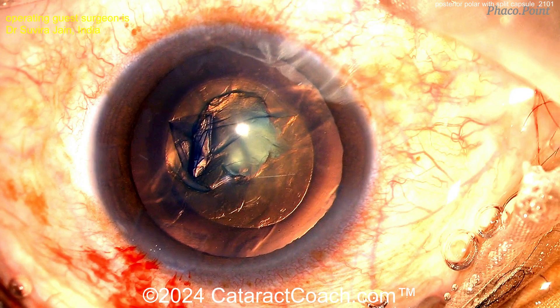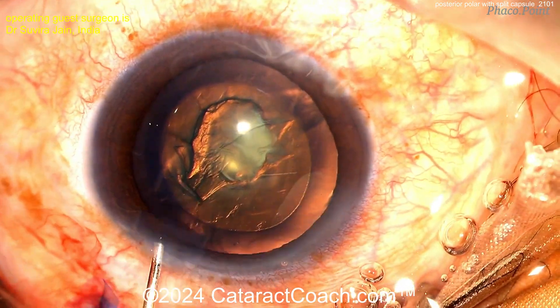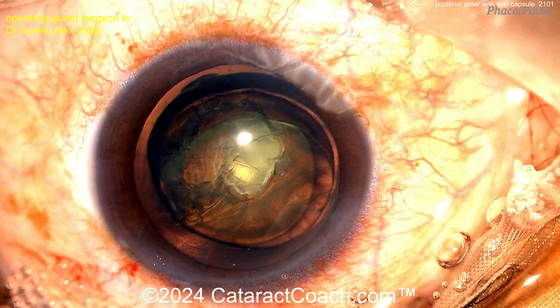From posterior polar cataracts, what do you want to avoid? Avoid hydro dissection here. You can do a hydro delineation and get that endonucleus separated, but no hydro dissection. Beautiful result there.